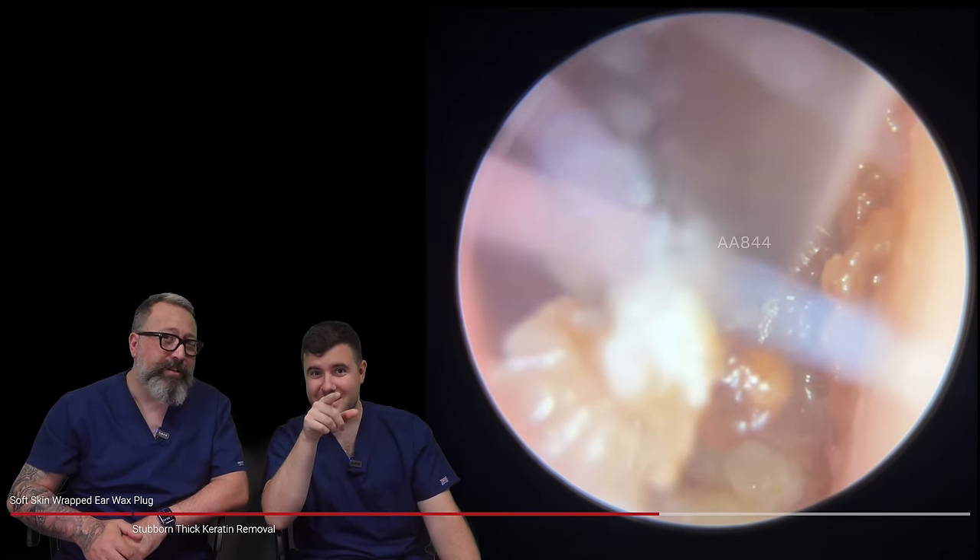You'll see once this comes out just how deep that portion of the ear canal is. I've opted for the Jobson Horne, hoping I can get a grip on the whole piece and bring it forward. Poor patient, putting up with that for such a long time. I've already mentioned it but this eardrum is not going to look clean or healthy — just giving you a bit of a warning. There's still some resistance, and you can see that piece sneaking off to the left hand side, going across the eardrum.